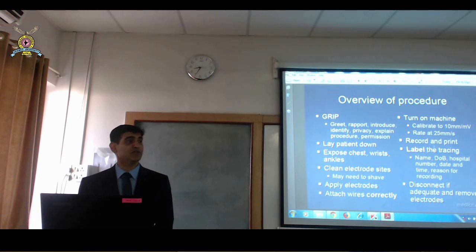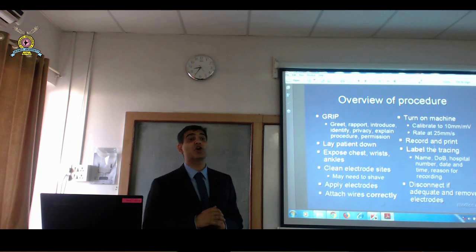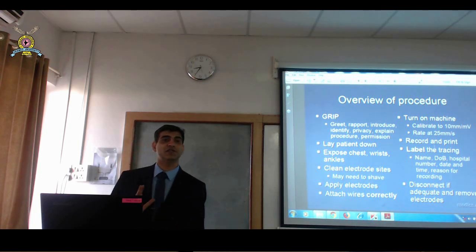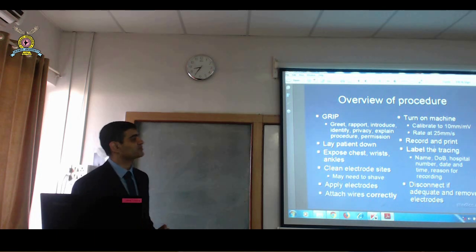Record and print the ECG. You don't take a photograph of it. ECG is an important document. It's an important legal document. So you have to record an ECG, print it, and place it properly. Why is it an important legal document? You know by now why it's an important legal document.